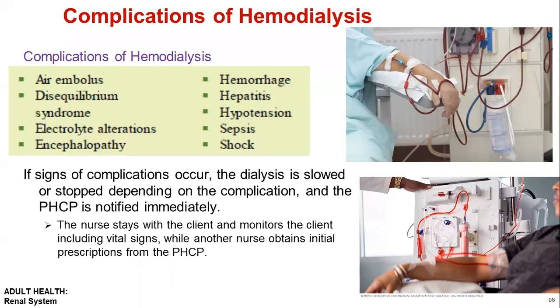And also the patient may develop hypotension during the hemodialysis. It is challenging to face. In case of hypotension, administer IV fluid or colloid or saline as prescribed. And also slow the exchange rate, right? And definitely if any sign and symptom of a complication develops because of hemodialysis, we always notify the healthcare provider.